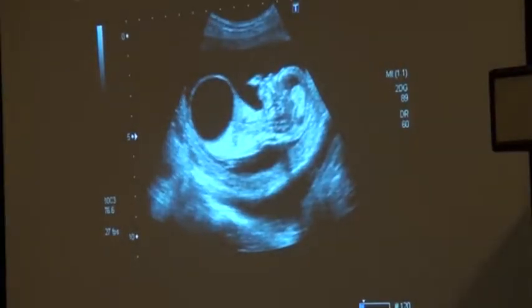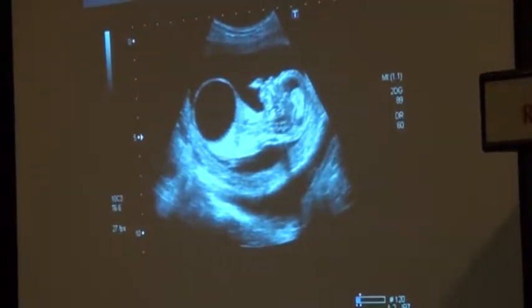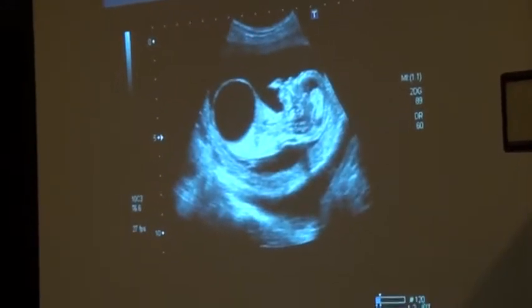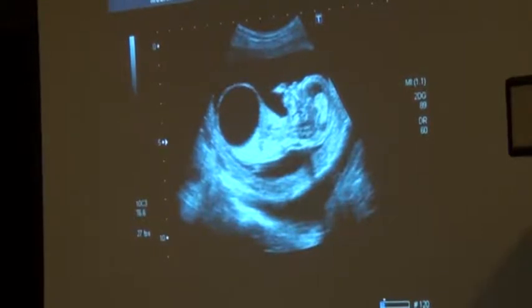When you see a cyst in the lower abdomen of the fetus, this is megacystis. This is abnormal. This fetus needs to be aborted. You don't say, I'll wait and see if it becomes all right. No. This is megacystis, which is an underlying chromosomal abnormality. If you see the same cyst at 20 weeks, it's not megacystis. So you must differentiate less than 14 weeks or more than 14 weeks.